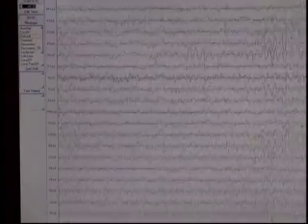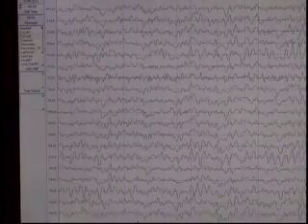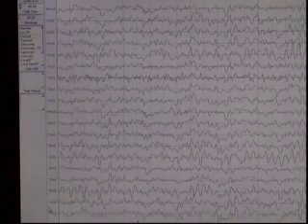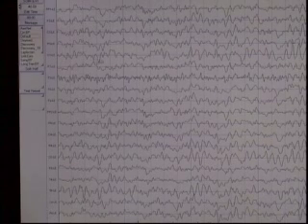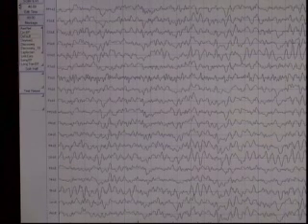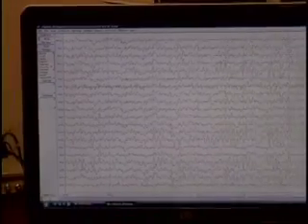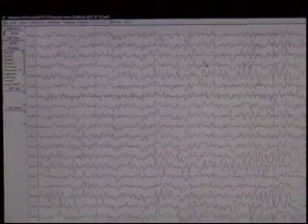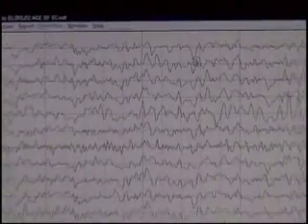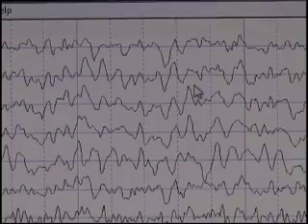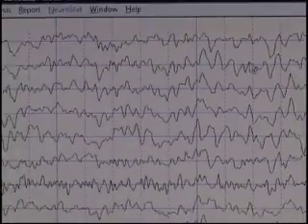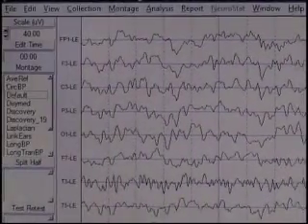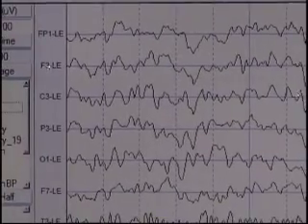Typically what's done to analyze the records is to pick sections that we think are typical and representative, and use those to generate a report. In this page I don't see anything terribly unusual. We do see a little delta activity going on in the front, particularly at F3, but I think that's probably part of the recording.